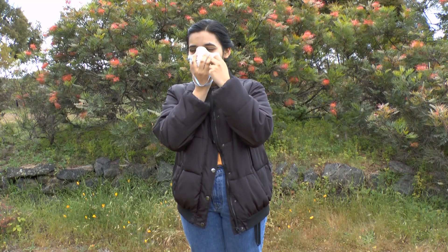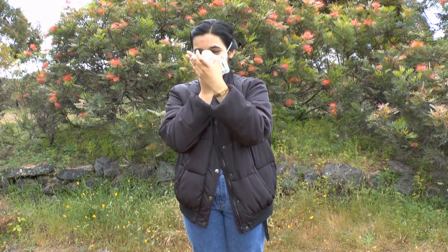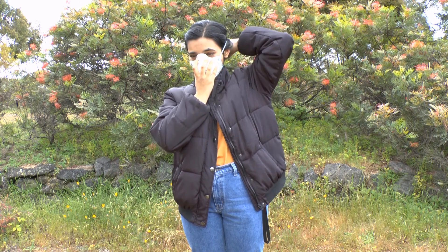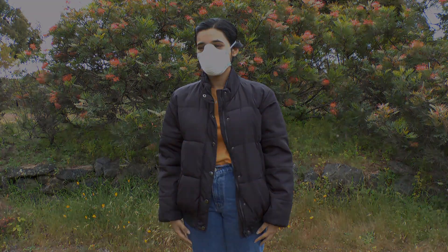While continuing to hold the respirator, pull the upper strap over your head so that the strap rests above your ears. Pull the lower strap over your head so that it rests on the back of your neck and the strap is below your ears.